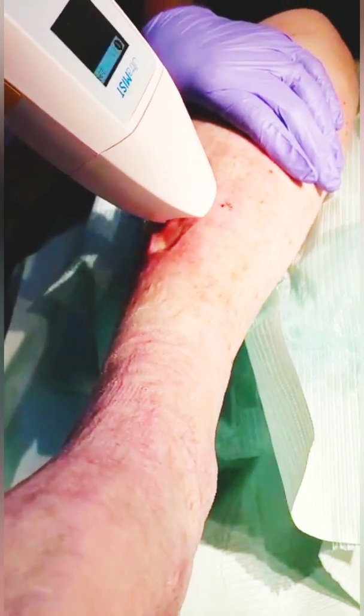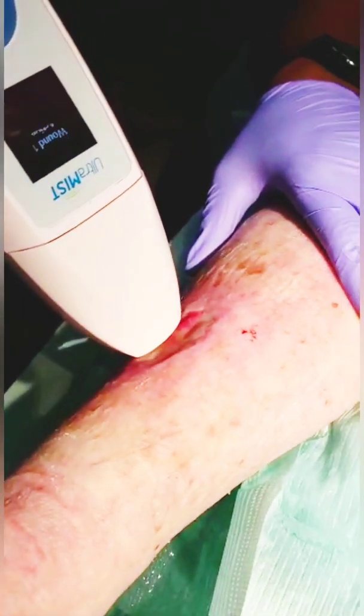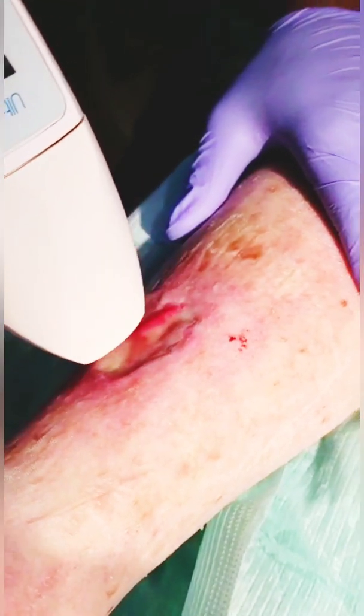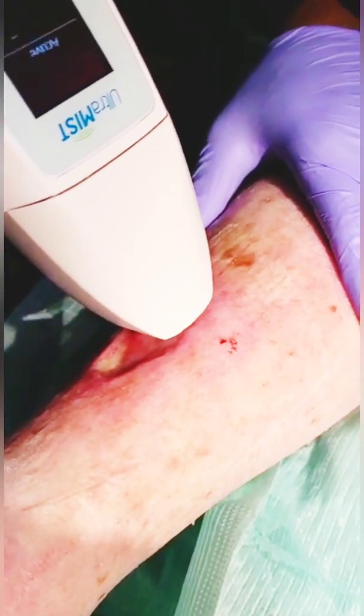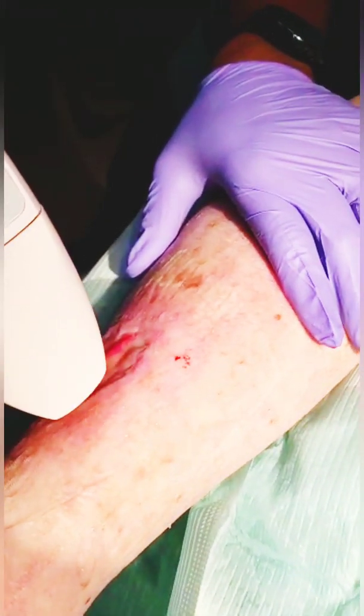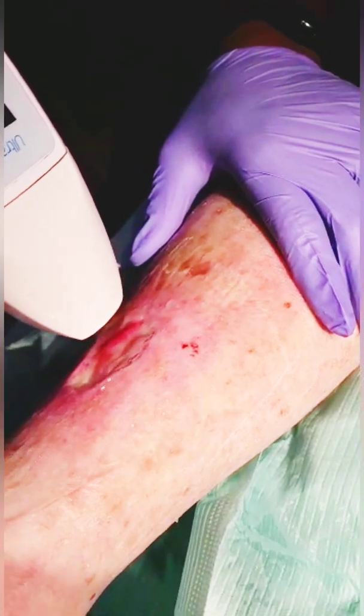Sometimes you can hear a little bubbling, and that means you're just right — you can kind of hear it hitting the wound surface. That bubbling sound comes from the saline, but it's your indication that you're at the correct distance from the wound and getting the full effect of the ultrasound. When you hear that spray, you know you're at the right distance. We're about halfway through — about two minutes in.